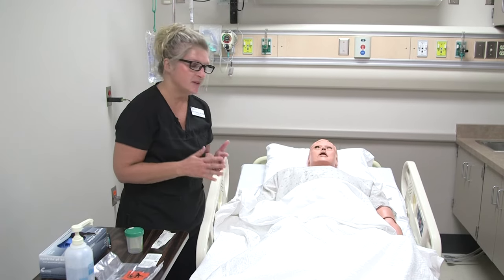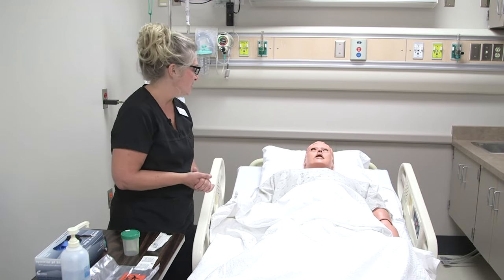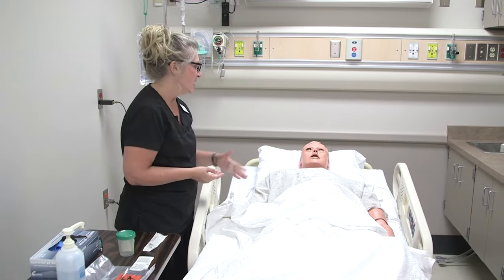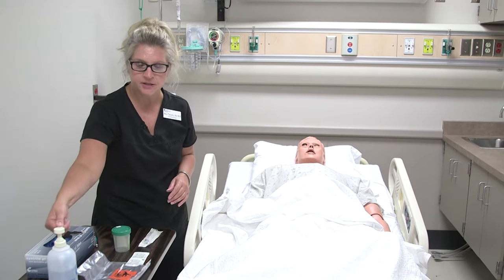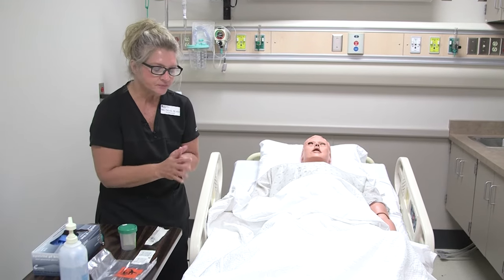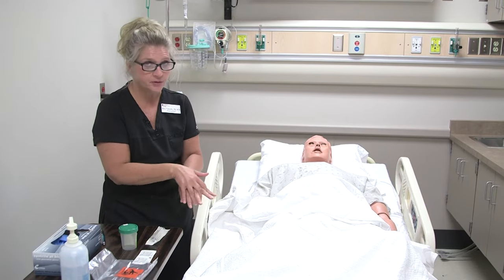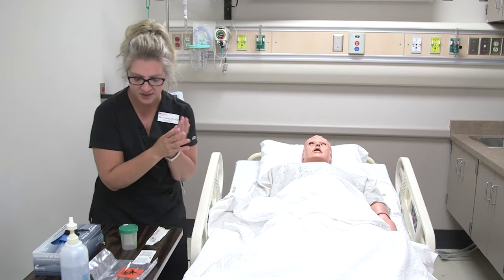I'm going to take a sterile urine specimen from Tim's catheter. I've already checked Tim's identity, made sure it matched my chart, and I explained to Tim what I was going to do. The provider has ordered a sterile urine culture and sensitivity, so I'm going to go ahead and do that right now. You want to make sure that you actually have an order for it, so check your order and see what the physician or provider wants.